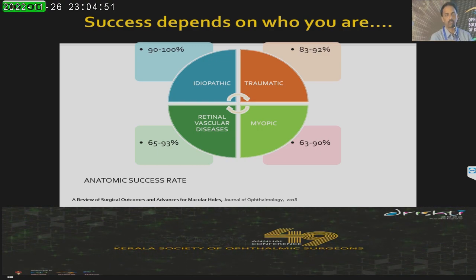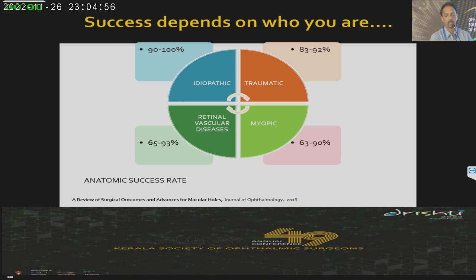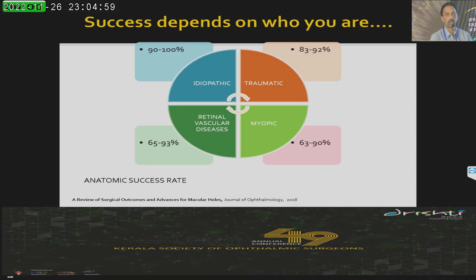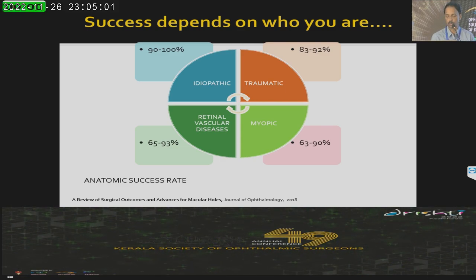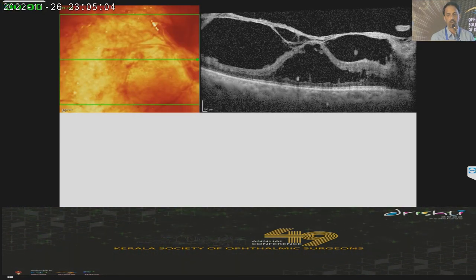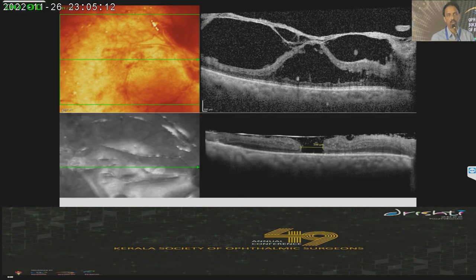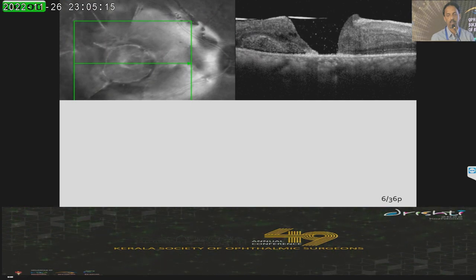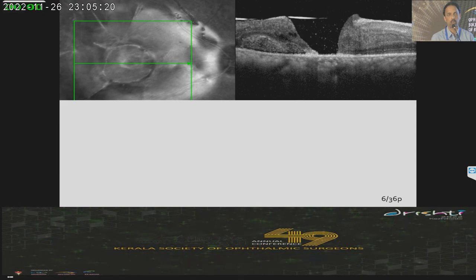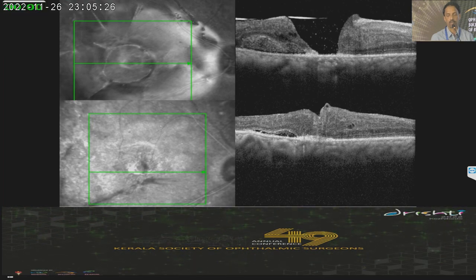The success depends on what type of hole you are dealing with. In idiopathic macular holes, the success rate is good, but in traumatic, myopic, and secondary holes, the success rate is not so good. In a patient with a thick posterior hyaloid and VMT, I did a vitrectomy and ended up with a hole under oil. By around four months, you can see epiretinal proliferation around the macular hole trying to open it up wider. When I removed the silicon oil, I did the peeling and stuffing-in, and we have a closed hole.